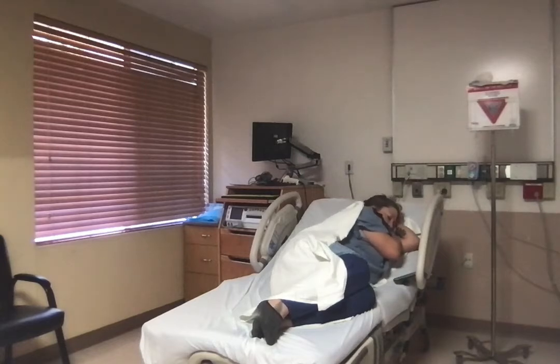After 10 minutes, the nurse notices that the fetal heart rate has improved slightly, but has not yet returned to baseline. The nurse prepares to administer another bolus of 1,000 milliliters of lactated ringer. After performing hand hygiene, the nurse re-enters the room.